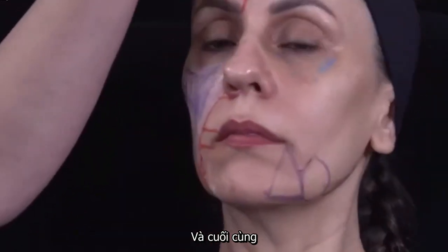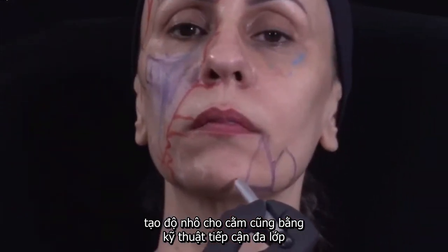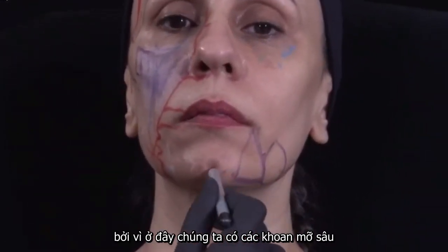And at the end, projecting the chin with, again, a multi-layering technique because here we have deep fat compartments.